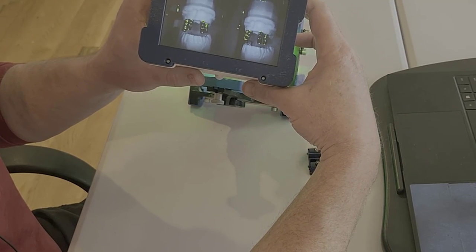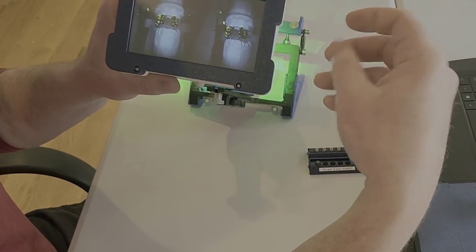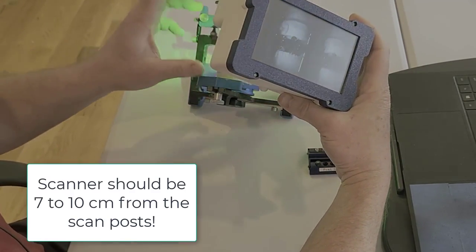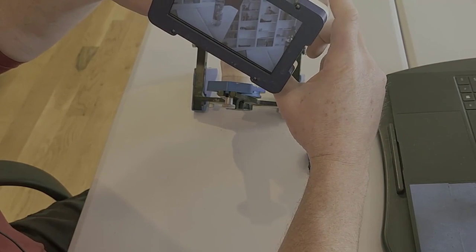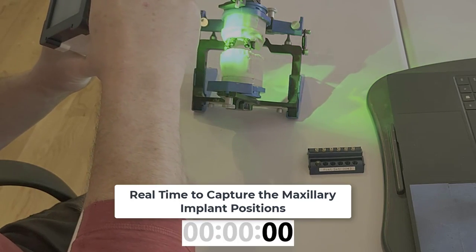If I'm too far back, I'll see the green spots, but now you're losing the focus of the camera. You're just outside of the focal distance. So the sweet spot is to be about 7 to 10 centimeters away from the posts. And as long as you do that, you're not going to have any trouble with this. So when you are ready to start capturing, you're just going to depress and hold the trigger button. And you're just going to kind of come laterally like this. All right, so there's my proper distance. I'm going to start capturing.